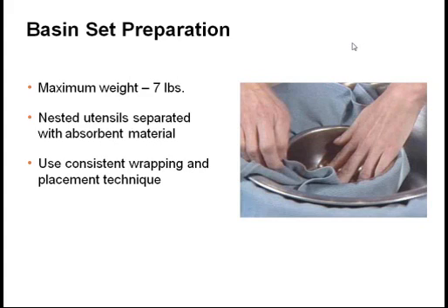Staff members who assemble, wrap, and load basin sets for sterilization should follow the same guidelines to facilitate proper loading for sterilization, with all items tilting in a position for drainage. Consideration should be taken when positioning utensils that have curled or turned rims, for example, emesis basins within a set. Stand basins on edge, since pooling of water can occur around the rim, creating a source for wet pack issues. Position hollow surgical light handles inverted with the handle end down in the basin when the set is tilted on edge to facilitate drainage for sterilization.